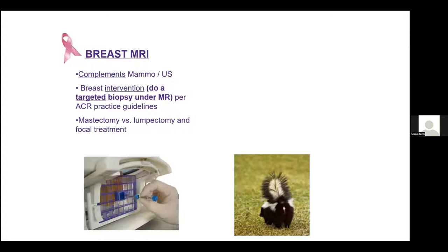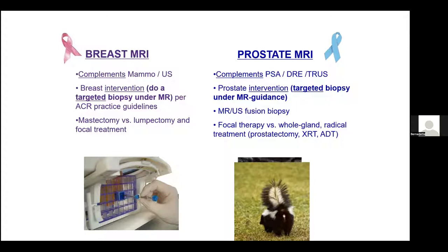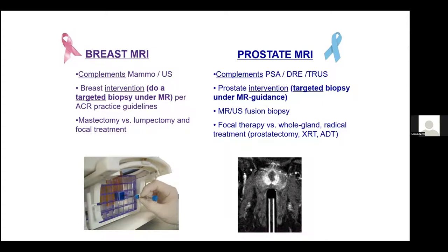breast cancer, especially in women with dense breasts, and how to do in-bore MR-targeted breast biopsy. And much of what was performed way back in the early 2000s was easily migrated to prostate. And slowly we were able to move prostate MRI into the forefront so that random biopsy could be a thing of the past and potentially even digital rectal exam. So I always say, if it looks like a skunk and it smells like a skunk, it's probably a skunk. If you could see it and you could put a needle in it, you could biopsy it.